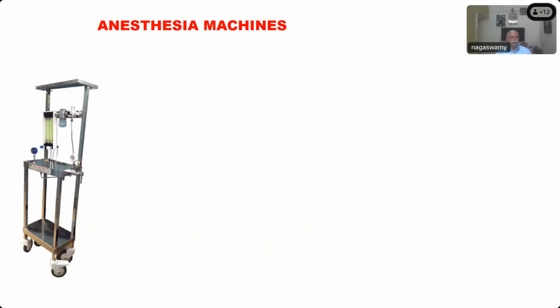What are all the things you find in this that are different from the modern workstations that you are using nowadays? All of you are very familiar with workstations because most of the corporate hospitals and even the government hospitals have started using workstations for the safety and good conduct of anesthesia for the patient's sake. So this is the old machine. Can anyone tell me the exact name of this model of Boyle's machine?